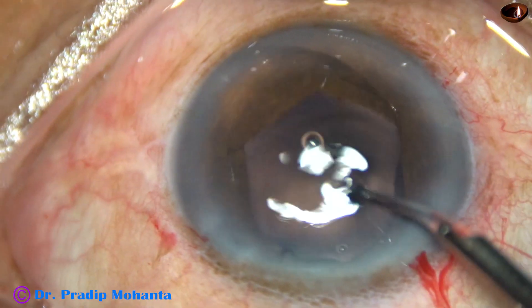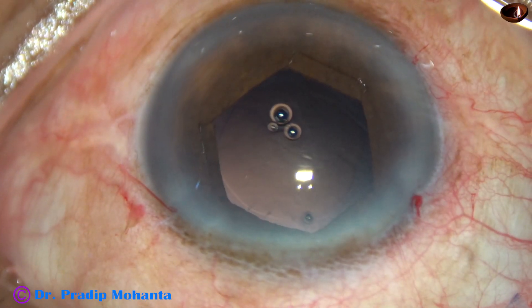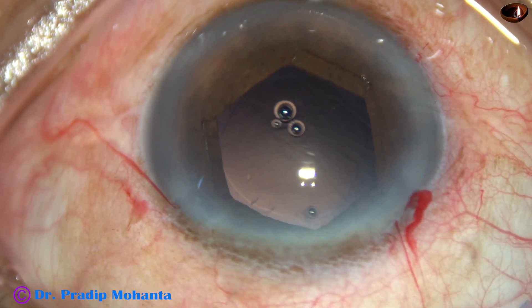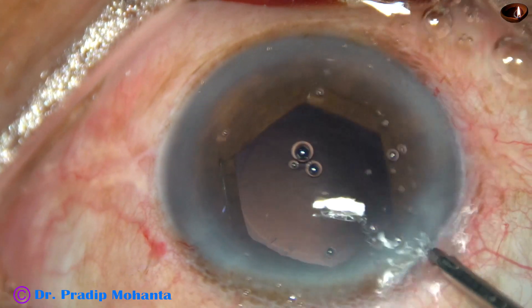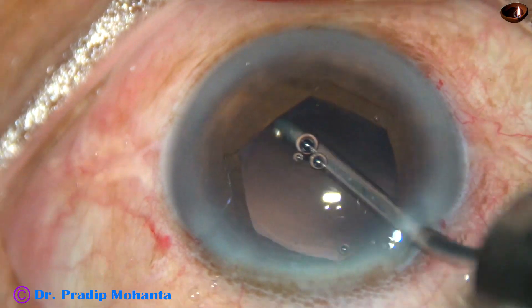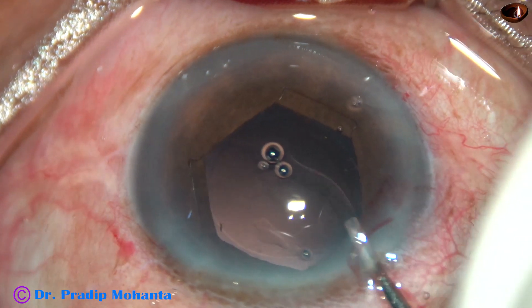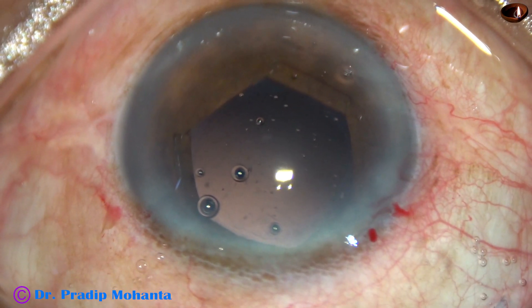Now I am using the irrigating probe of bimanual irrigation-aspiration for polishing the posterior capsule. The irrigating jet is directed towards the posterior capsule and polishes it very nicely. Viscoelastic is injected — this is 2% HPMC.